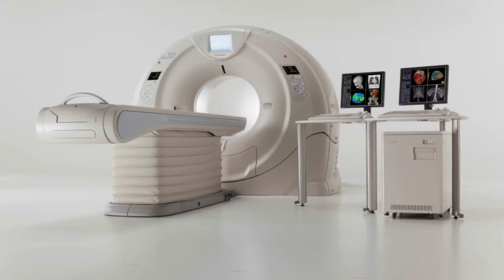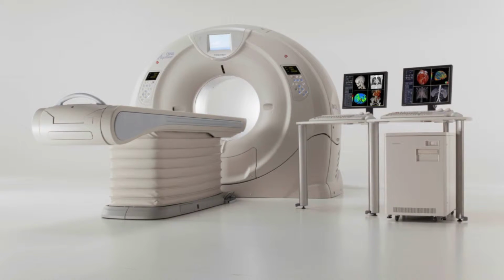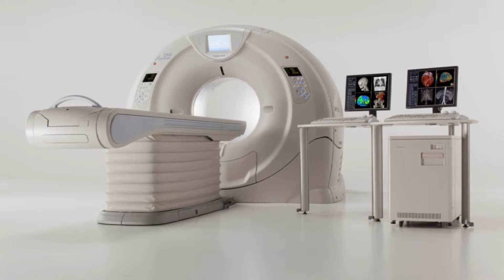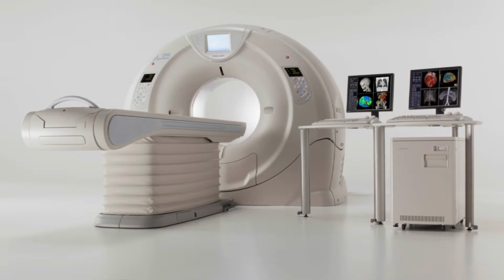This is the donut, the bore or gantry where the images are taken. There's no external moving parts. You just hear a little bit of a buzzing noise, and that's it, and it's very quick. And this table can be moved in many different directions, which is very useful for a variety of patient sizes and applications. And here's a nice diagram that basically shows you how fast a 320 slice cardiac CT works.